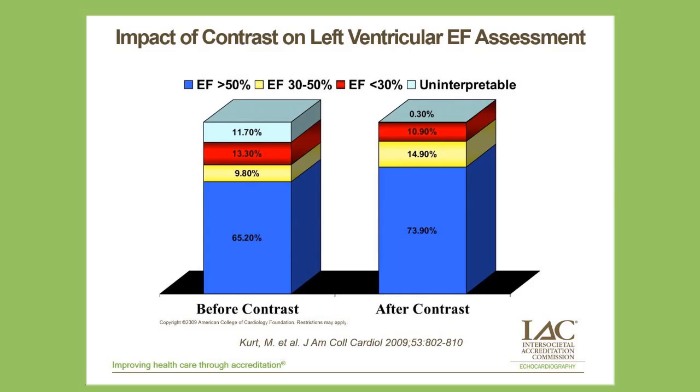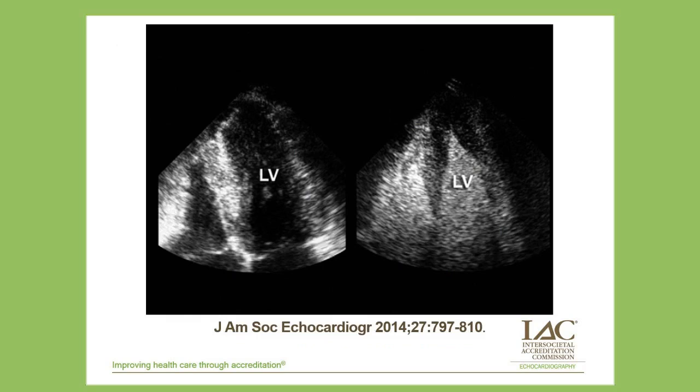So this technique, with just low mechanical index imaging alone, just using that harmonic behavior of the microbubbles, shows great potential in the intensive care unit setting, as well as in any situation where windows can be difficult, to lessen the need for additional diagnostic testing and make a study more reliable and definable for the referring doctor.